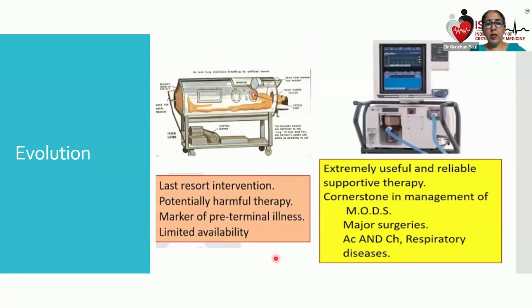It was usually a last resort because ventilators were not that developed, and it was thought to be a potentially harmful therapy, used in pre-terminal illness: if nothing is going to happen, put the patient on a ventilator maybe. Such ventilators were massively used in the polio epidemic. But now we have very sophisticated, computerized, user-friendly ventilators with a lot of modes and a lot of alarms.